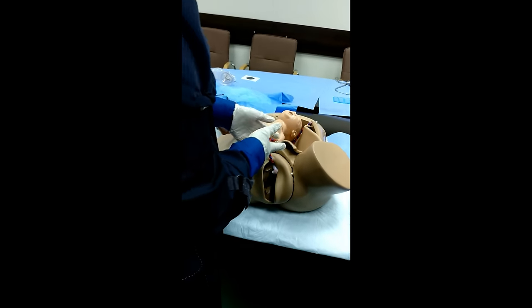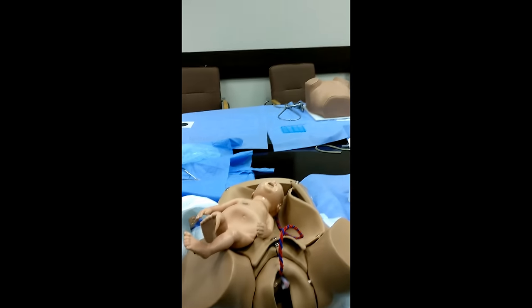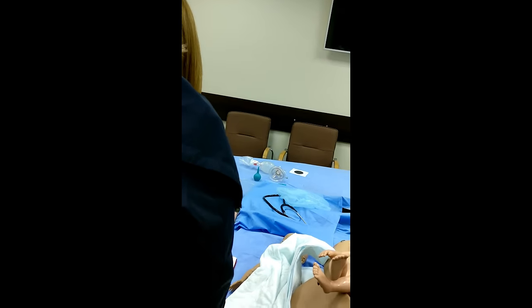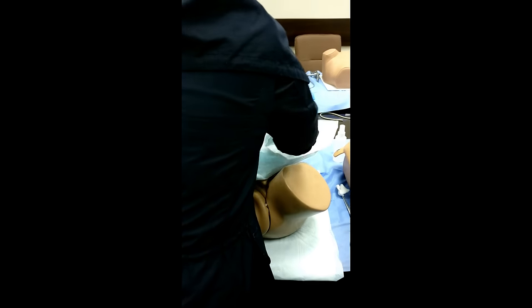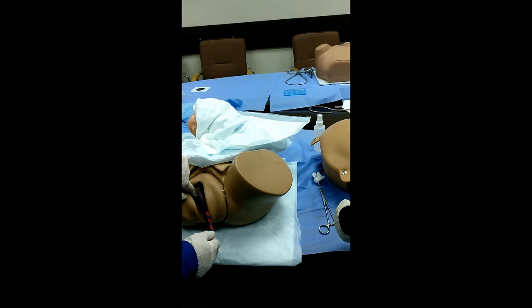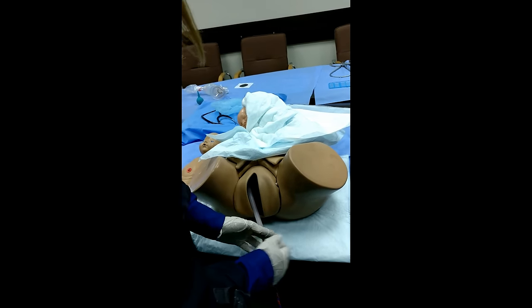So the third period is active management, clamping of umbilical cord. Active management of the third period of labor. Is the placenta. So, we introduce oxytocin. First, the cord is supposed to be clamped. Give me the instruments, please.